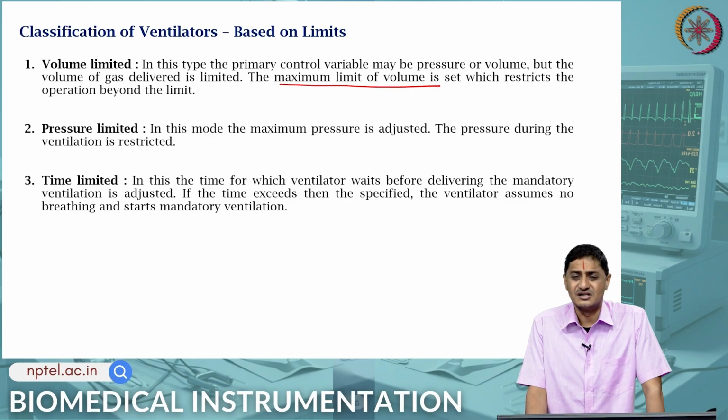Pressure limited is the case in which maximum pressure is adjusted. So, you want to control the value of pressure that is maximally applied, because a higher pressure may cause damage. So, that is the other case, pressure limited. So, the maximum pressure is adjusted.